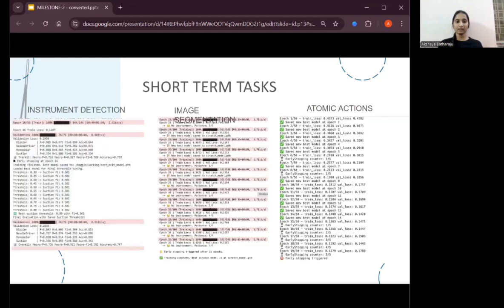The training and the training accuracy. We trained our models on annotated data from the GRASP dataset. The training followed strict parameters to ensure high accuracy. We have used optimizers like Adam. The loss function is binary cross entropy with logits for multiple label outputs. We have run up to 100 epochs with early stopping to prevent overfitting.